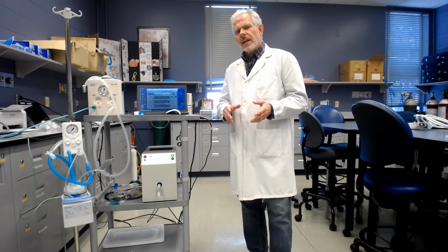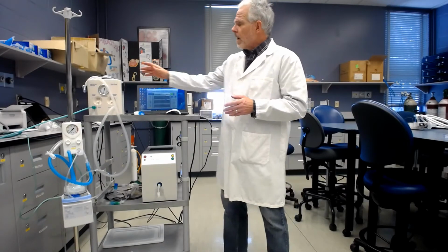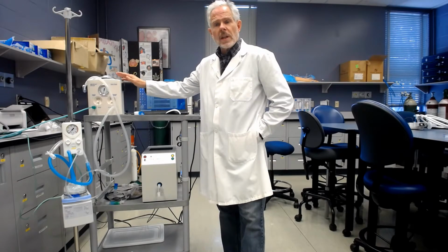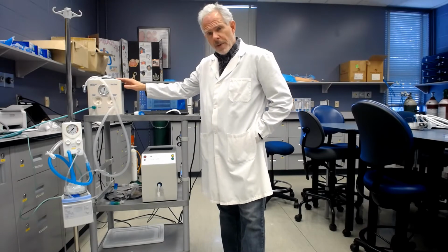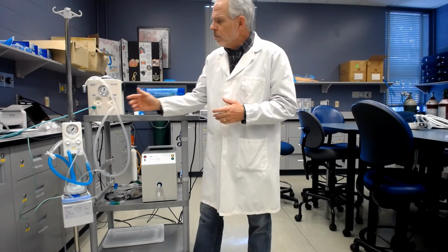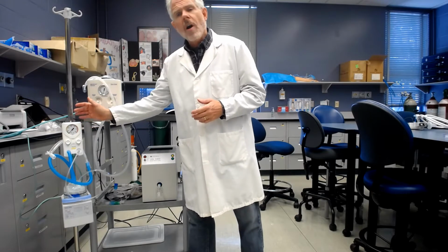Hi there, my name's Alan Prost, and what I'm going to demonstrate today is a difference in performance between our standard resuscitator, which we've been using for a long time and been very successful with, the Neopuff, made by Fisher & Paykel for resuscitating newborn babies. And I'm going to compare that to a relatively new device on the market, the Inspiration rPAP device.